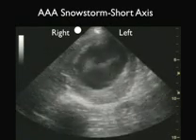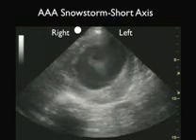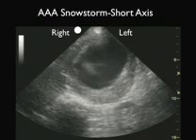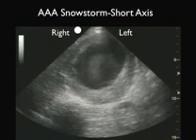And we can see here that in a large abdominal aortic aneurysm, the flow of blood can be very turbulent, causing deposition of this blood onto the walls of the abdominal aorta, causing thrombus burden to occur.